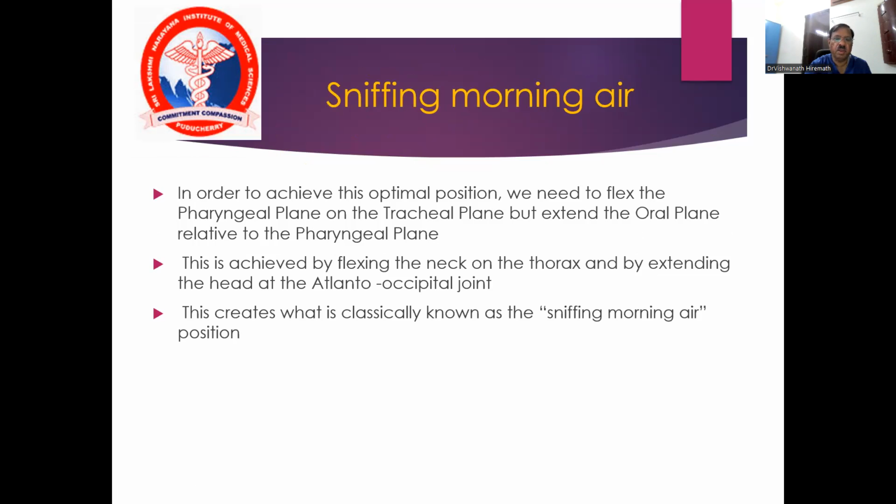This is achieved by flexing the neck on the thorax and by extending the head at the atlanto-occipital joint. So, flexion of the neck, extension of the atlanto-occipital joint. This creates what is classically known as the sniffing morning air position.